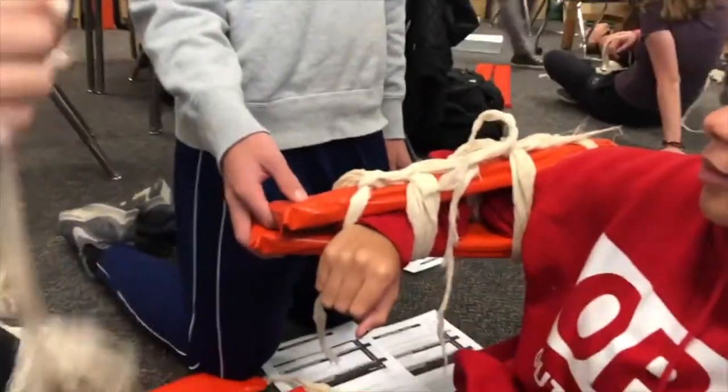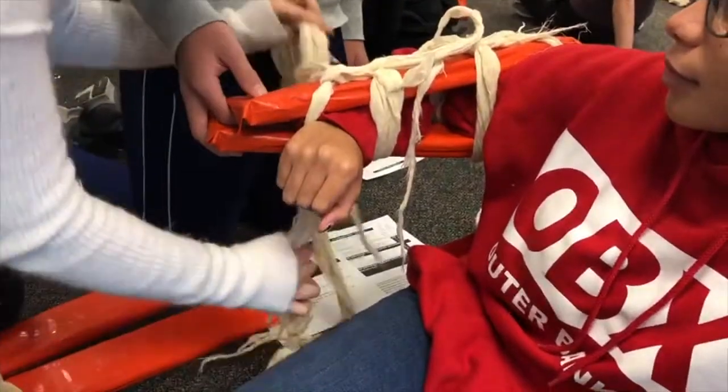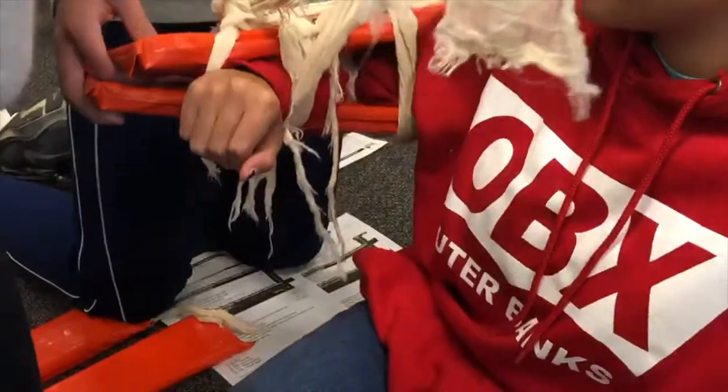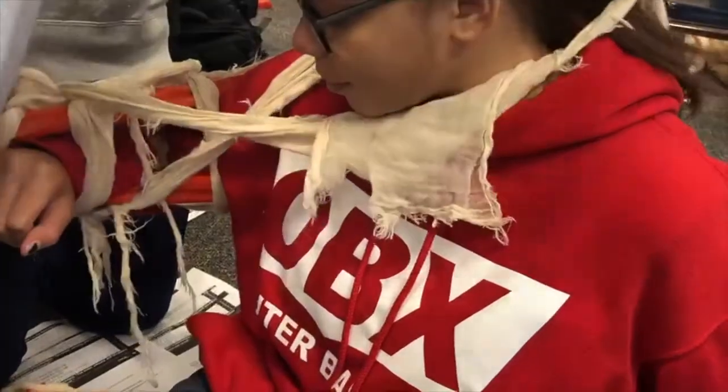Then you're going to take one of these. You're not going to cover the elbow, because that's what's broken — you don't want to put pressure on it. You're going to twist them and wrap it around. With the elbow, you don't want that in the elbow. Keep it right there, so it's not pushing into the neck. Don't do it super tight.